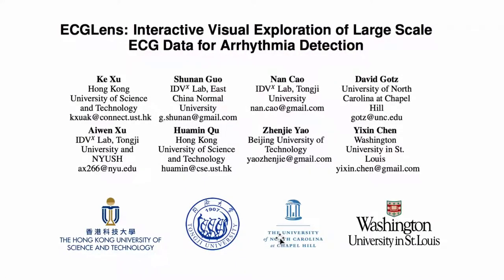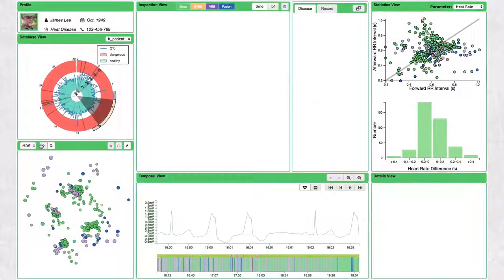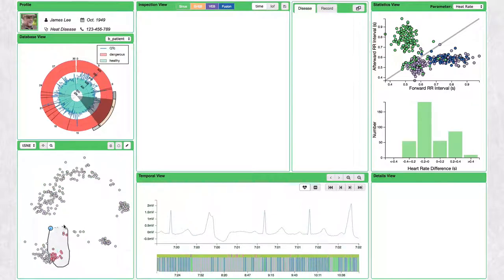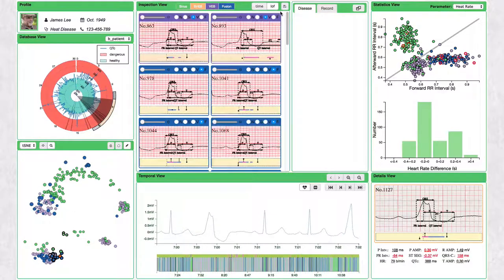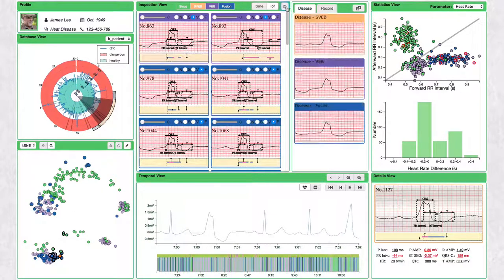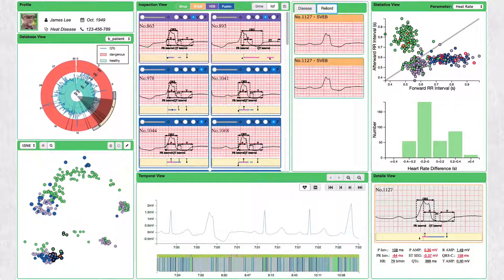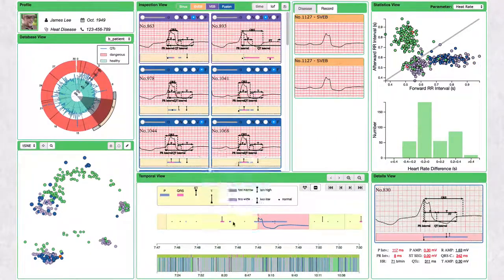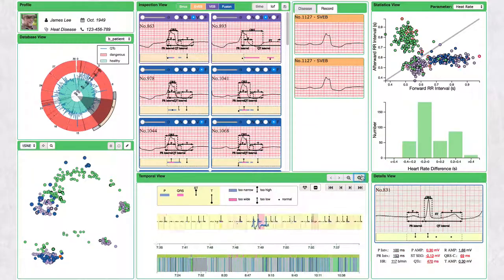We present ECG Lens, an interactive system for arrhythmia detection and analysis of large-scale ECG data. Our system integrates an automatic heartbeat classification algorithm based on a convolutional neural network and an outlier detection algorithm, as well as a set of rich interaction techniques.